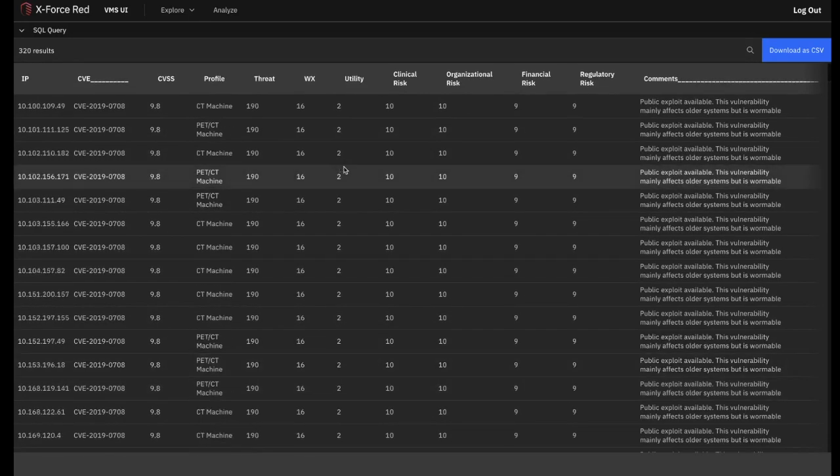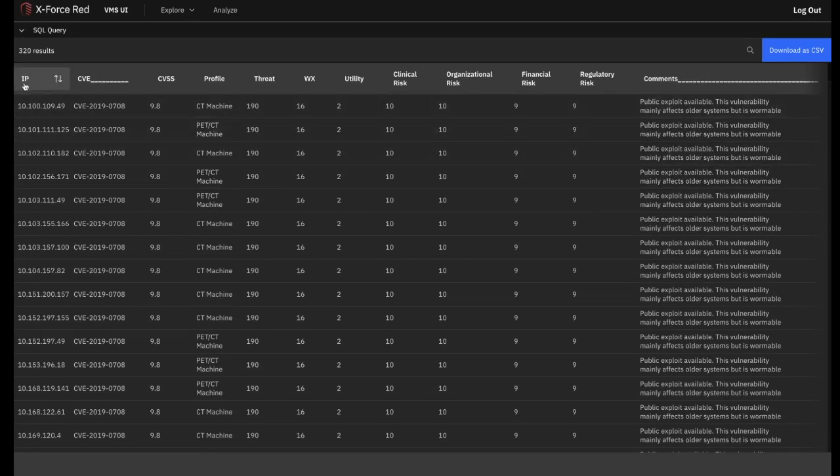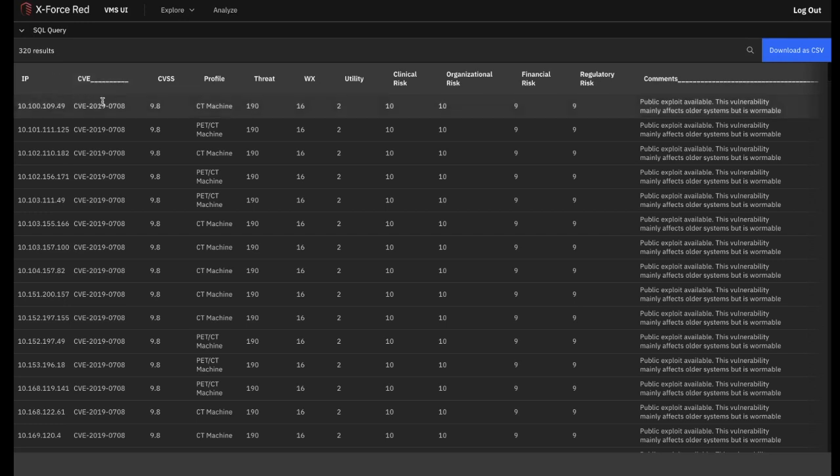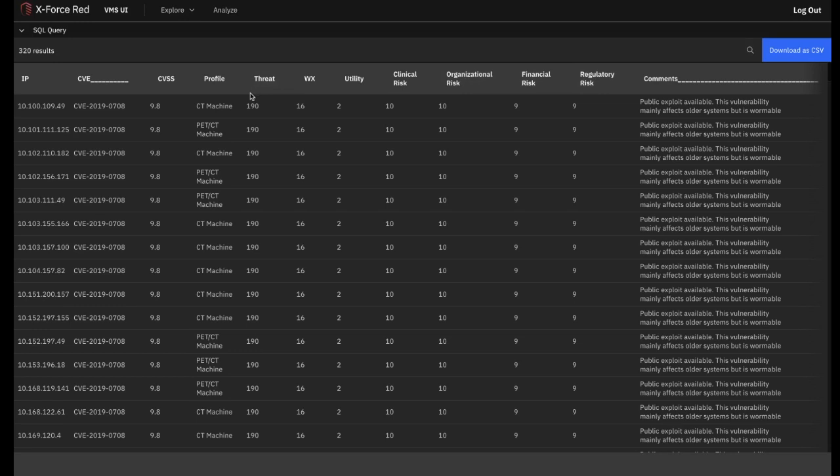For each instance of a vulnerability, you will see the IP address, followed by the CVE ID of the vulnerability, its CVSS score, and then a high-level description of the endpoint in question such as CT machine. After this, you can see the combined threat score again that captures technical and clinical risk in a single score. This table is sorted high to low by default using this metric. WX or weaponization represents the number of known exploits for a vulnerability in the wild. There are 16 for this particular vulnerability.